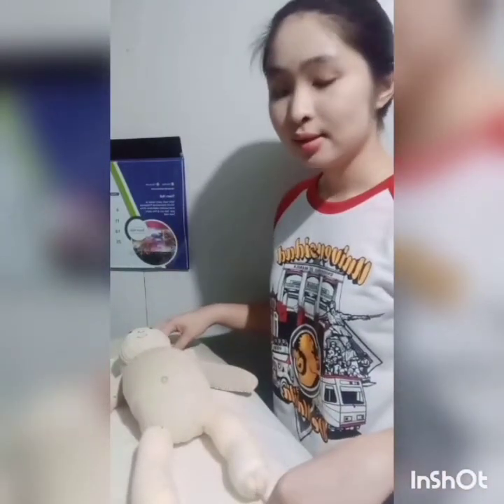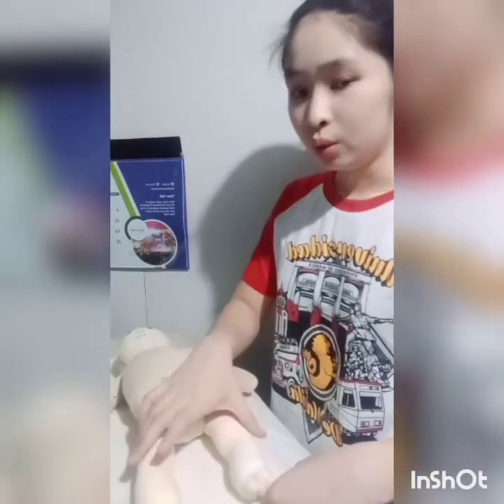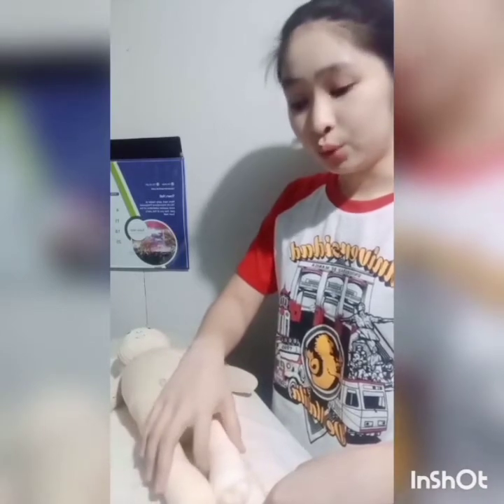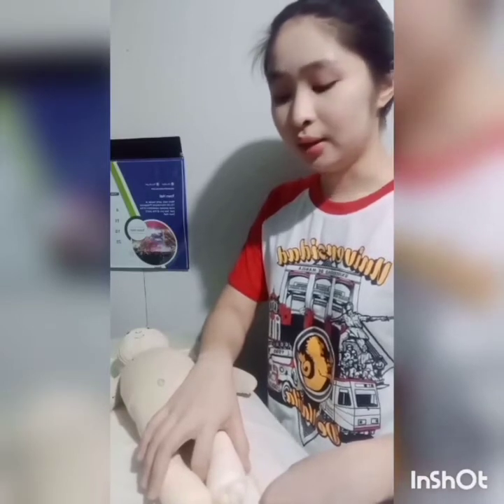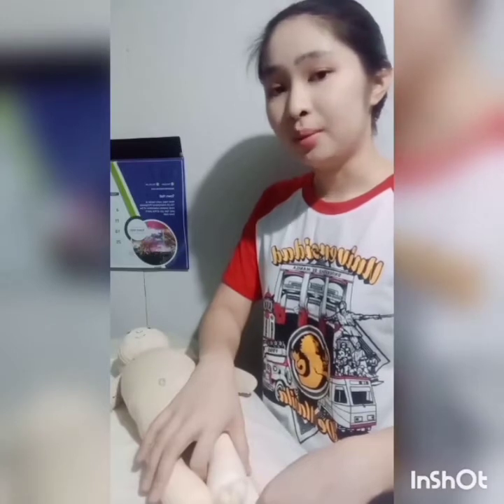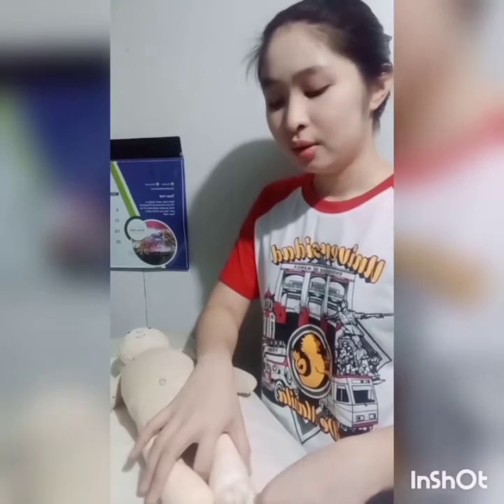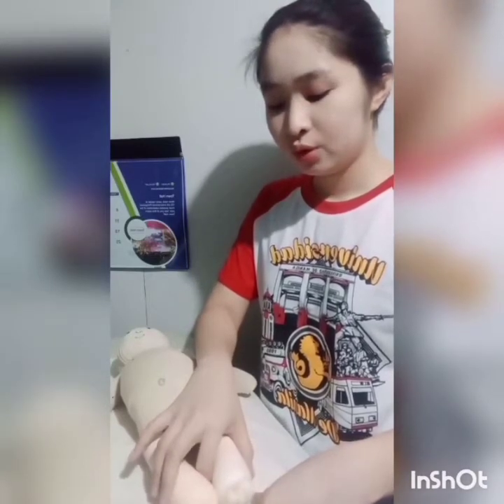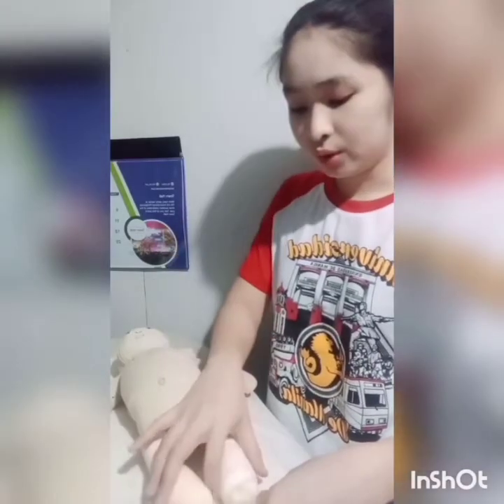Getting the baby's length starts from the top of the head, and we're going to put a little pressure on the baby's knees, just a little bit, not causing harm and injury to the baby, because newborn and premature babies, their legs are very fragile, and we need to take care of those, not to really stretch it, just enough to its limit.